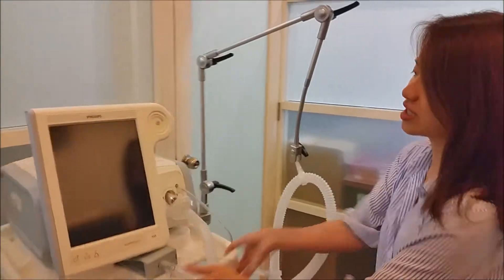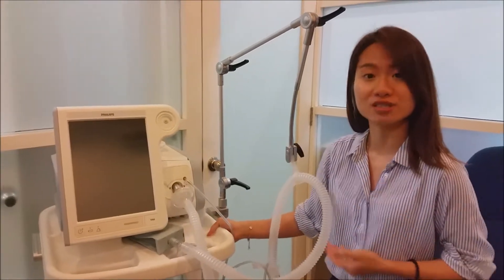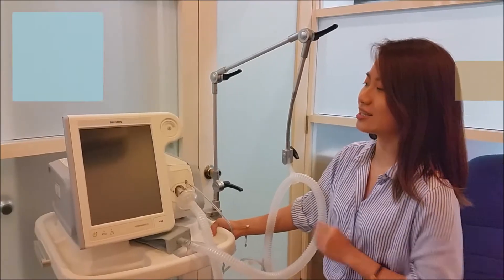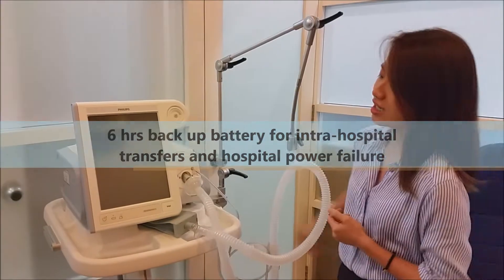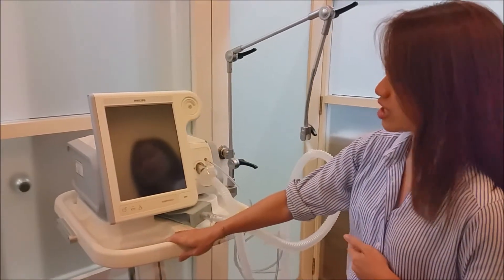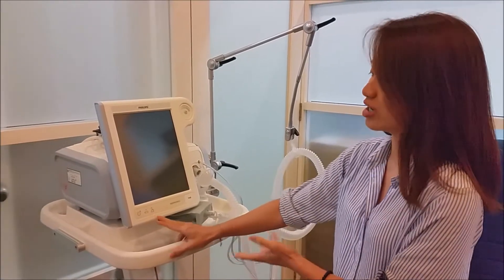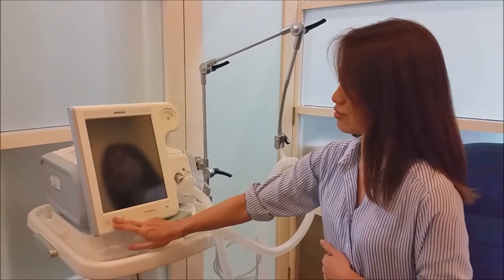The difference between this machine as compared to the BiPAP version, as some hospitals already have it, is that this one actually runs on battery as well, which has a 6-hour backup battery. Also, the start button is at the front now instead of at the back. So if you are used to the BiPAP version where the start button is at the back, now you can just start it at the front.